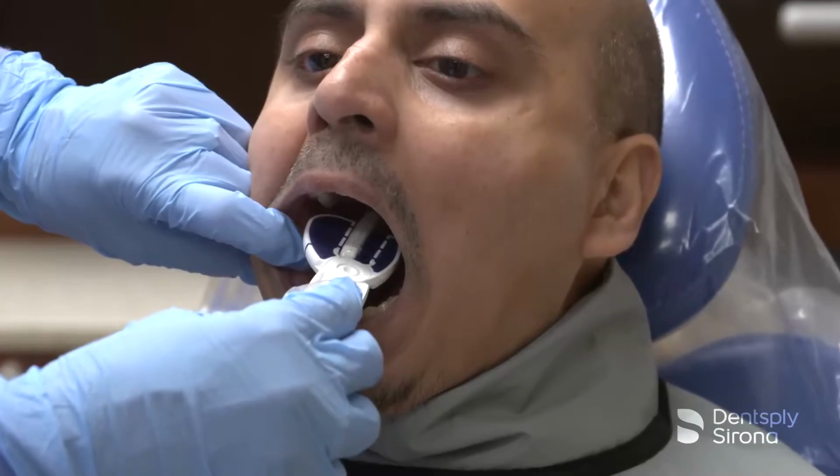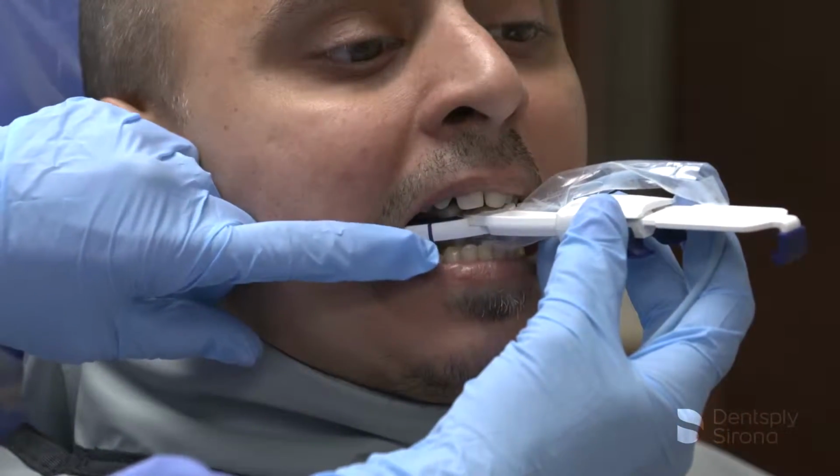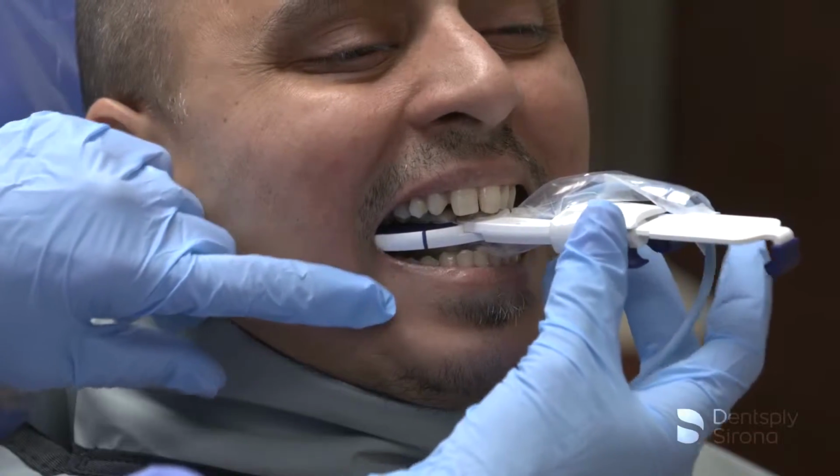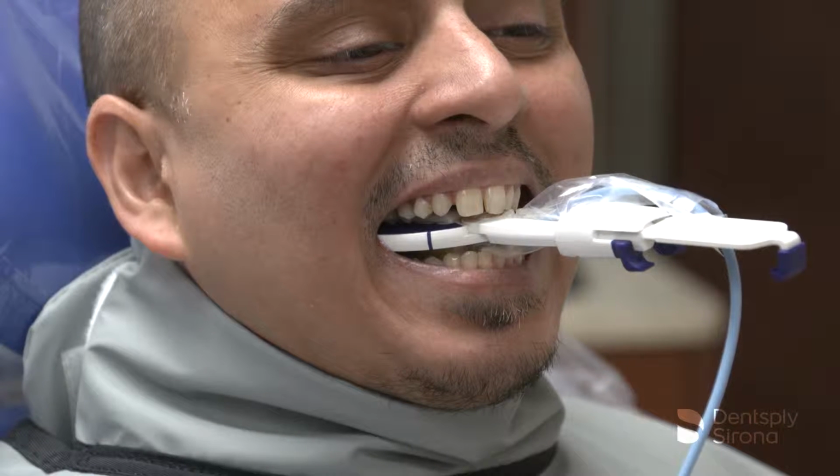Place the sensor behind the teeth of interest and have the patient close slowly. Utilize the purple guide to help align the PID edge so that the clinician avoids horizontal angulation errors.